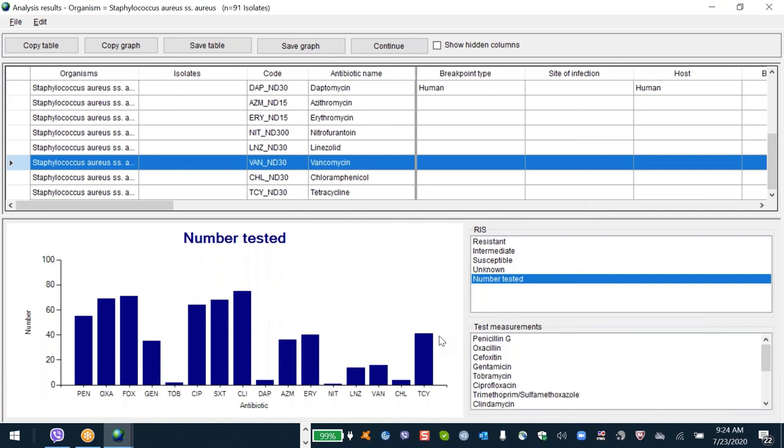Yes. So you always want to understand why is this so rare? Or sometimes it's a typing mistake. Like you see E. coli with penicillin, it's just usually a typing mistake. That's also data cleaning. I did this overall for the country.